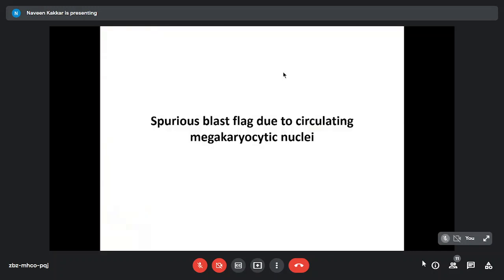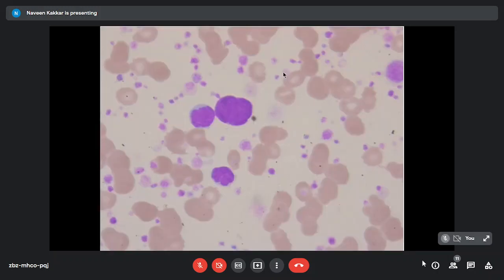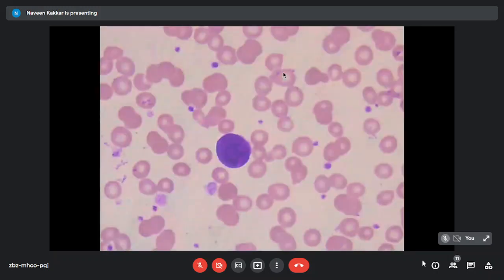These were actually circulating megakaryocytic nuclei. Myeloproliferative disorders, essential thrombocythemia, myelofibrosis, CML can all have this. This patient has an unusually high number, which was being counted or flagged as blasts.